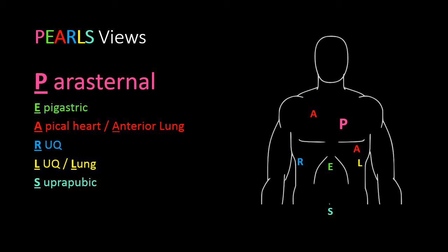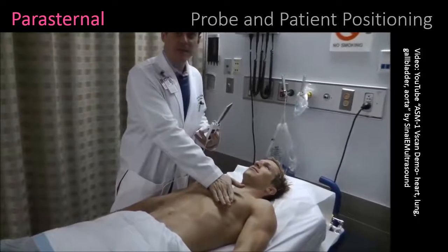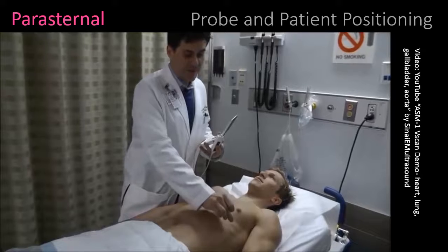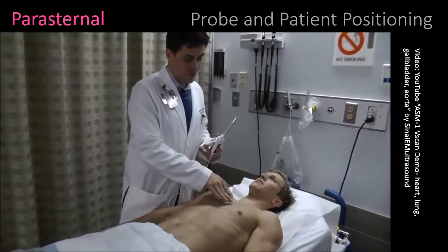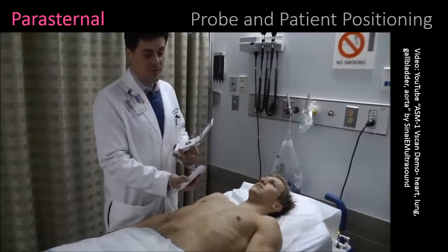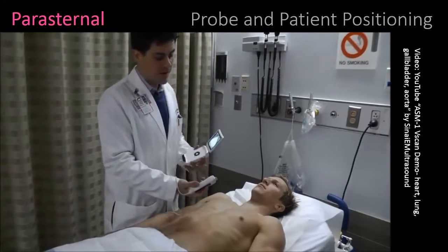The first view that we will discuss in the Pearls views is the parasternal. And really you can go in any order in this exam. You don't have to start with the parasternal, but for the sake of the acronym, we'll start here. So this gentleman is pointing out where the heart lies in the chest, and this will help us to know where to place our probe in the various cardiac views that we'll obtain.